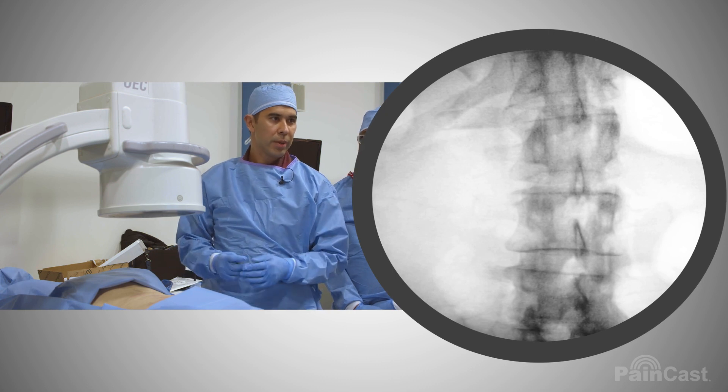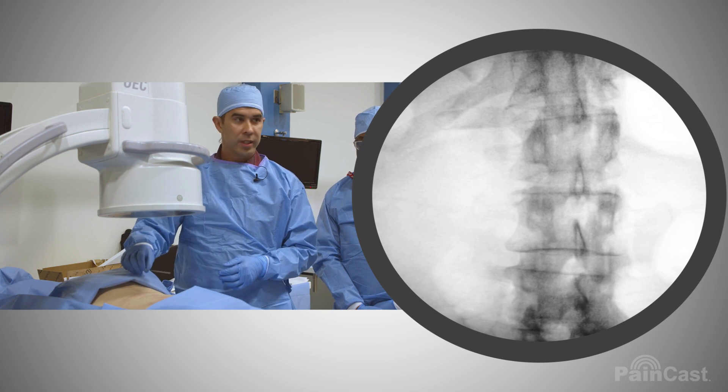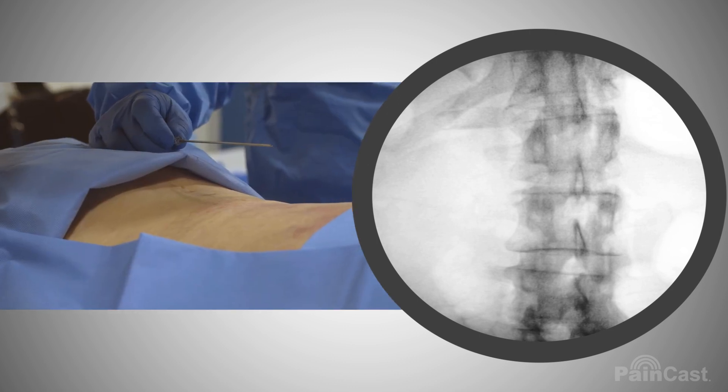So we're going to do a placement of a DRG stimulator lead here, and for this our target is going to be the L1 foramen on the right side.